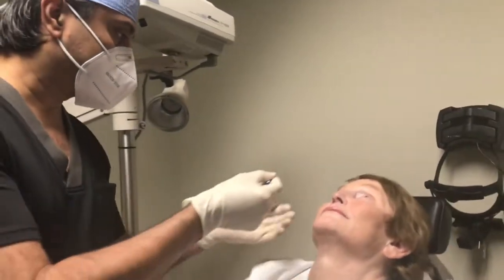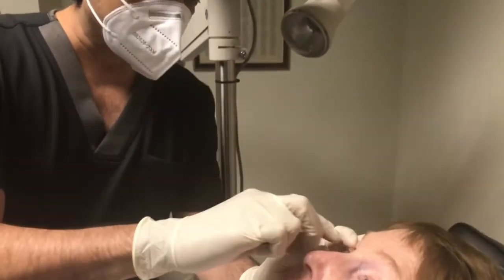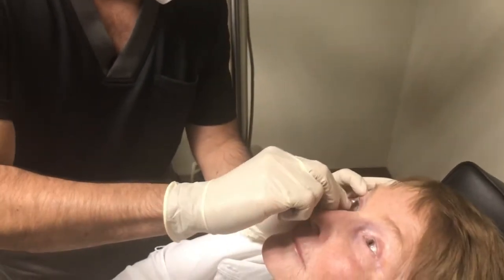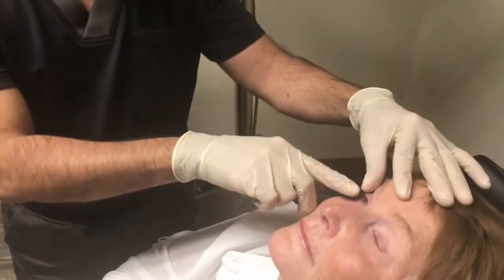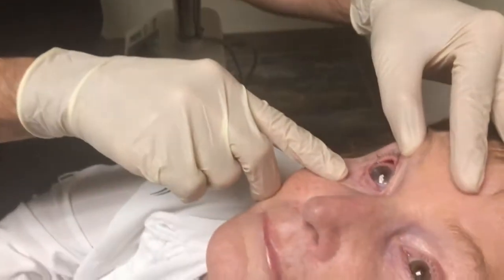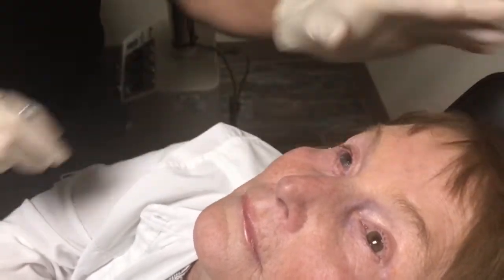Eyes wide open. There we go. This is a more difficult case because she's had blepharoplasty — her lids have been tightened in plastic surgery. But even then, you see how nicely it's slid into place. And here it is, perfectly covering the cornea with the membrane, and the ring is under the lids right here.